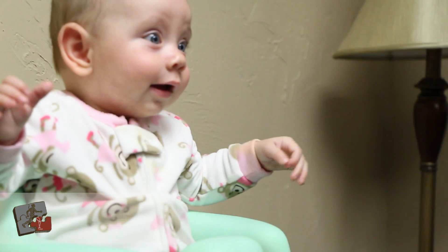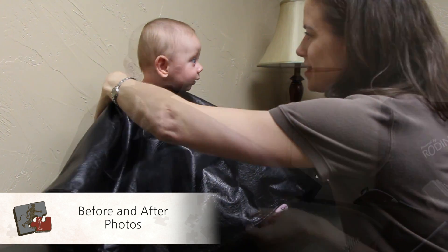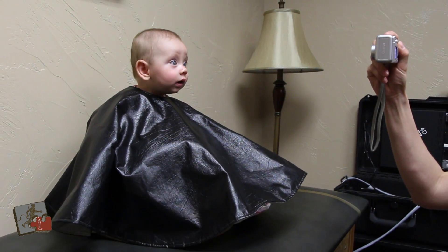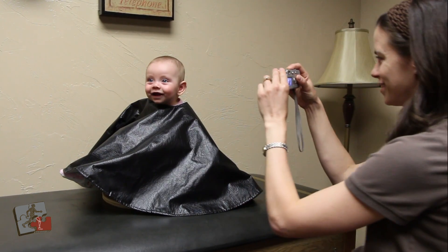If it's decided that the child would benefit from a cranial remolding helmet, we first take photos of the child's head from four different angles. We use these photos to compare what the child's head looks like before and after the cranial remolding process.